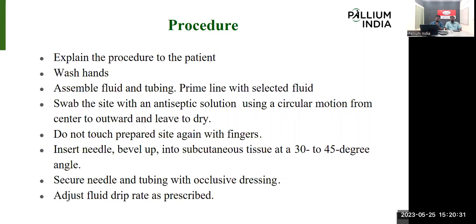Means we need to keep one IV cannula there and start the infusion on that selected subcutaneous area. So this is the procedure. For this procedure, as with every procedure, we need to explain it to the patient. I also experienced this in the palliative care setting: the subcutaneous route of administration is very new, and it is new knowledge for them.